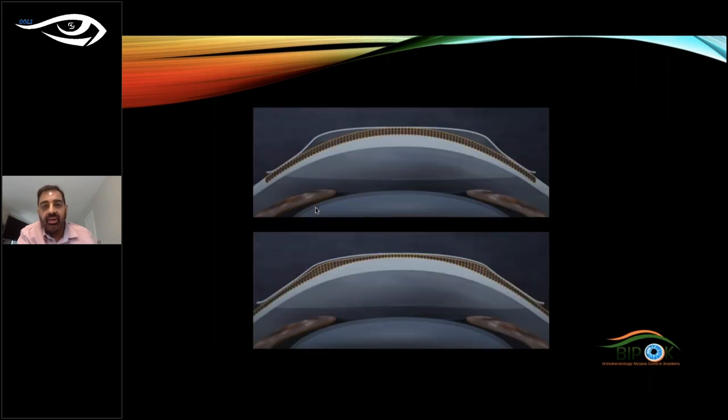Now, the idea of orthokeratology is basically for a lens to fit and for the tissue to move. The epithelial layer has to move. That's what we're really aiming for. So what you're seeing from this picture is the movement of the cells. Now, it's fluid forces. There's also what we call compression forces taking place at the same time, which I'll talk about in a minute.